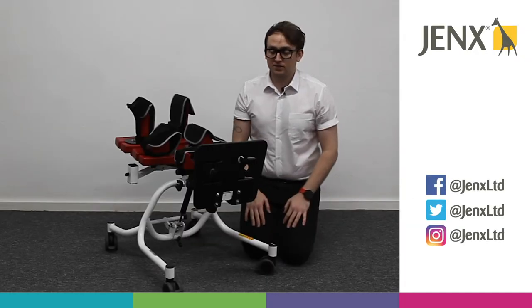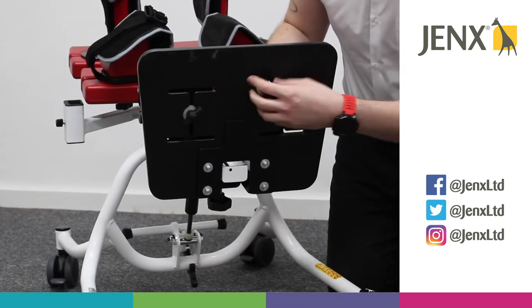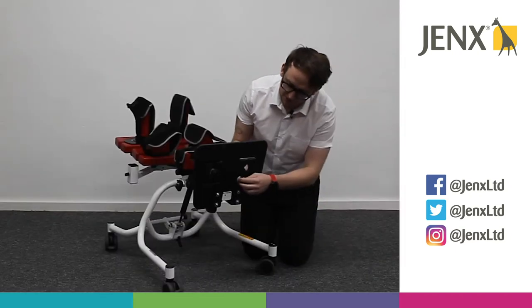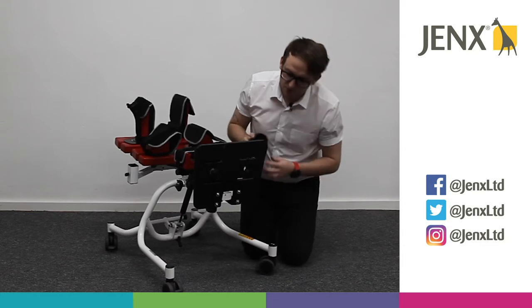If we're looking to adjust the sandals, we've got wing knobs on the base of the sandals. By loosening them, we're able to move along the track here to get any position that we need.